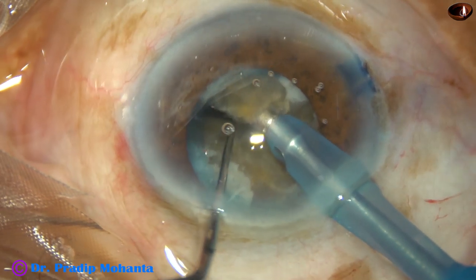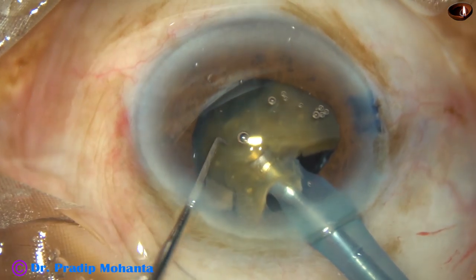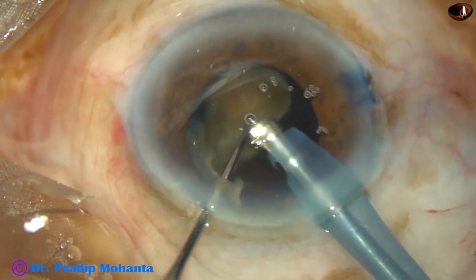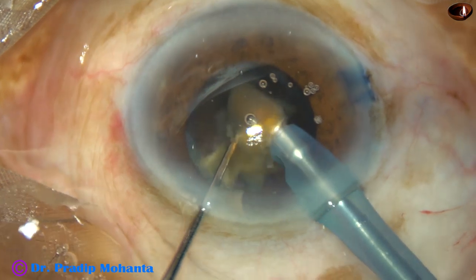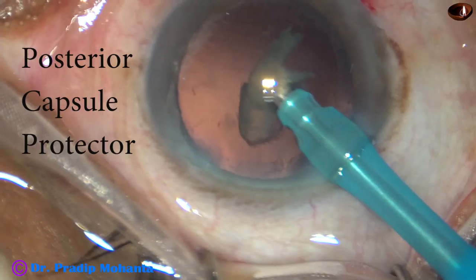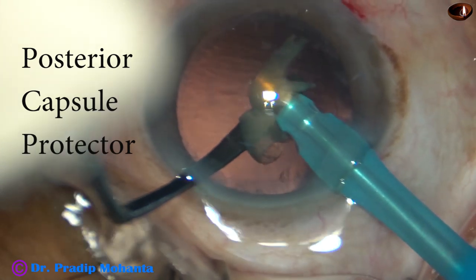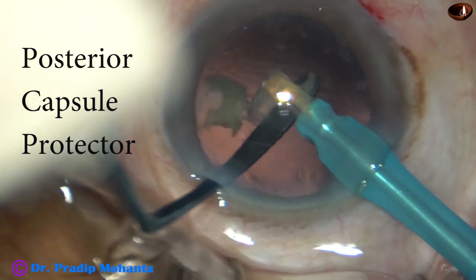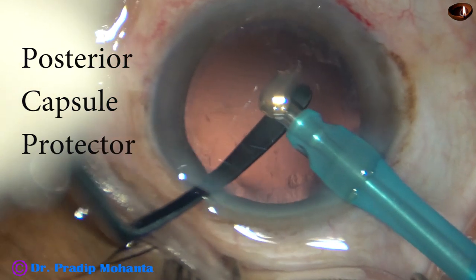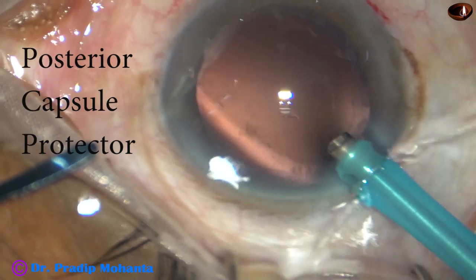In this case I tried direct chop but I was not successful. So I flipped the nucleus and I could emulsify it. But it is dangerous — we can see there is trampolining of the posterior capsule. Nowadays I use this instrument designed by me; I call it a posterior capsule protector. It has a contour which conforms to the posterior capsule and you can emulsify the last piece while being at the iris plane.